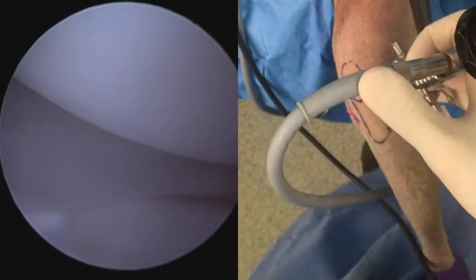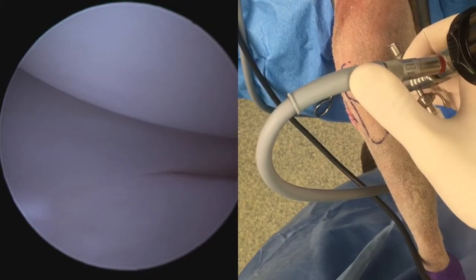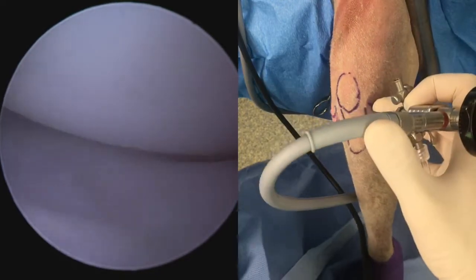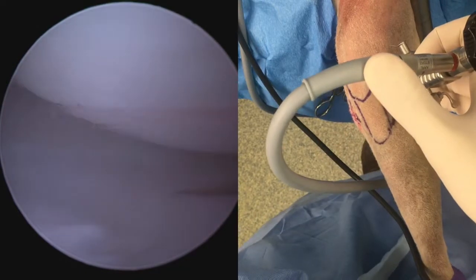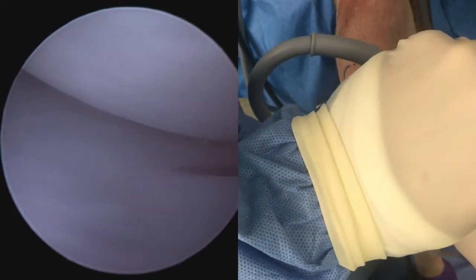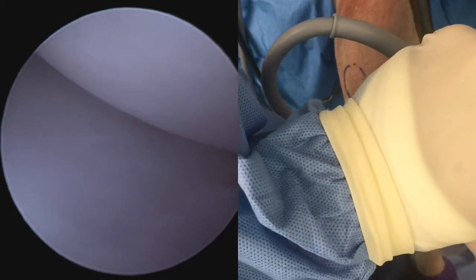In order to have a look at the medial meniscus, we're going to lever the joint into valgus. You can see here's a neutral position, then valgus, neutral, valgus — and you can see how we can manipulate the joint and open up that medial compartment just by altering the position of the leg.